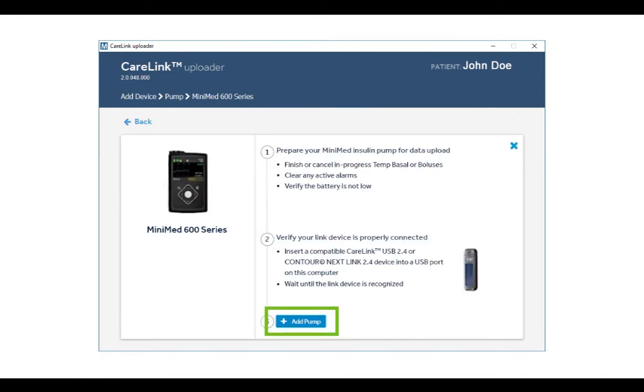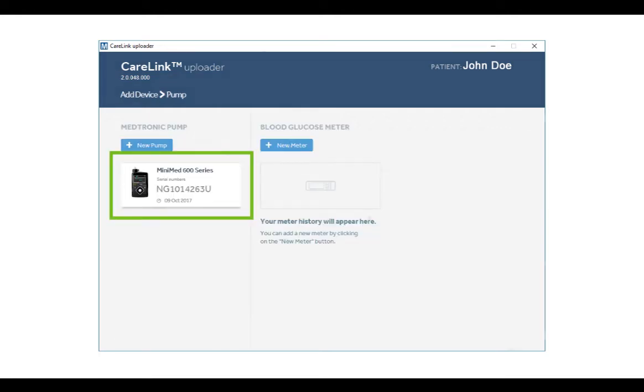The next screen lists things to watch out for before you can upload successfully. Make sure your device is ready by reviewing the checklist on the screen. Click Add Pump after the test is complete and you can start your upload.